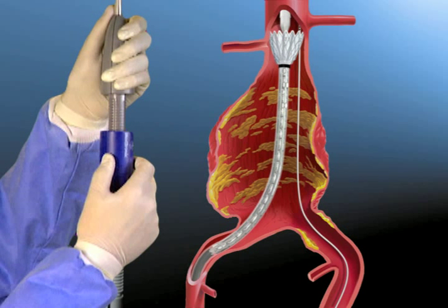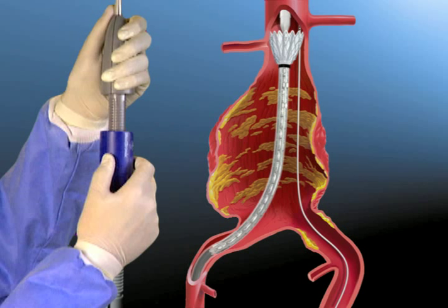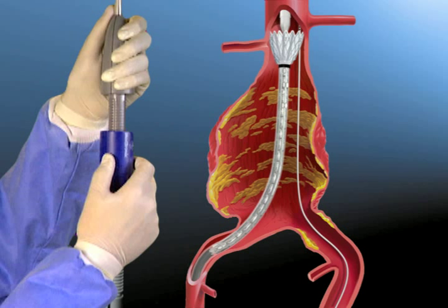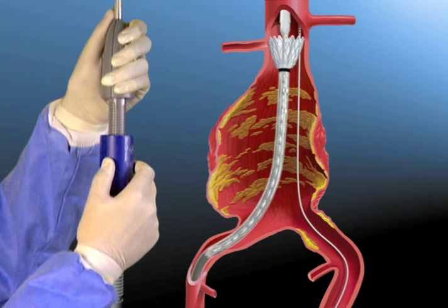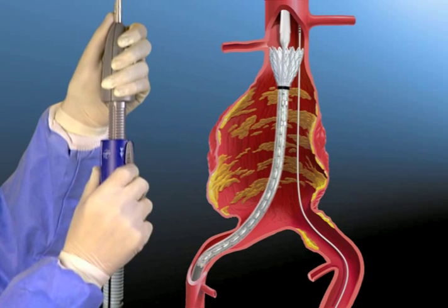Retract the graft cover two centimeters until the four top proximal radiopaque markers are seen. Adjust the stent graft position to just below the lowest renal artery by pulling down on the entire Accelerant Delivery System.